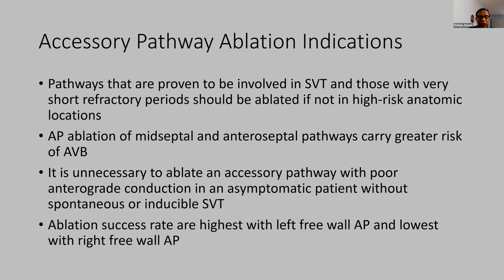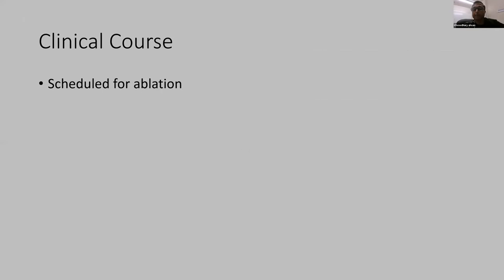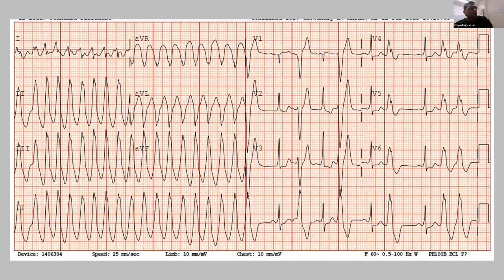But can you go back to the first? It is actually what Atahar pointed out. I'm so sorry, as Atahar bhai pointed out, there is a delta wave in the sinus beat. And this is actually a WPW. When we scanned, we did not scan the baseline EKG, but it is irregular.